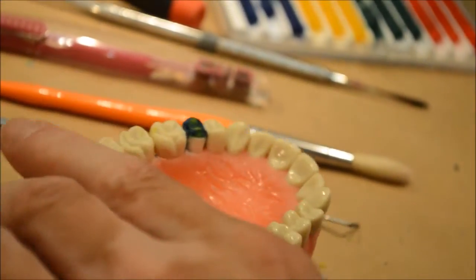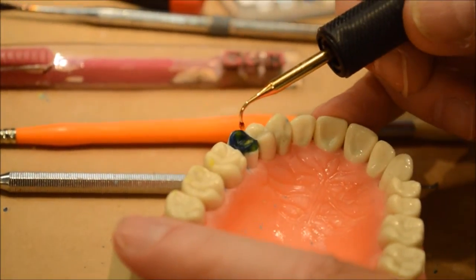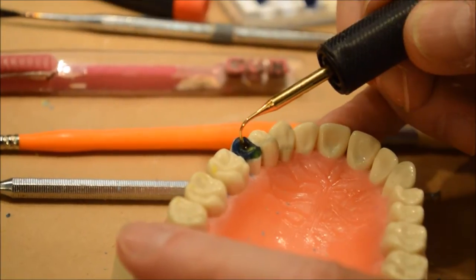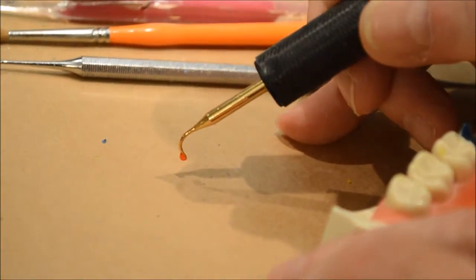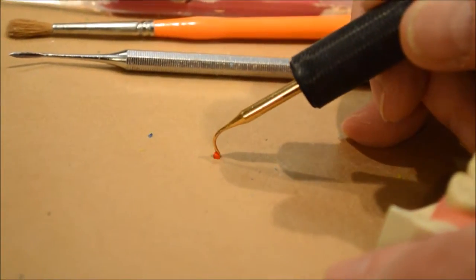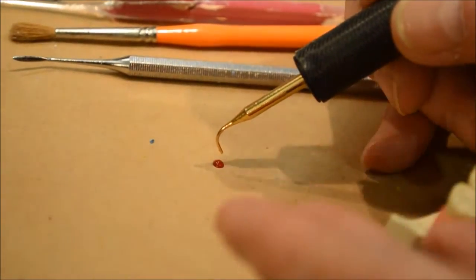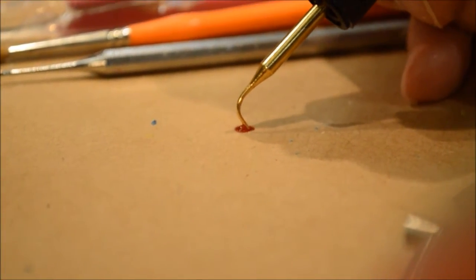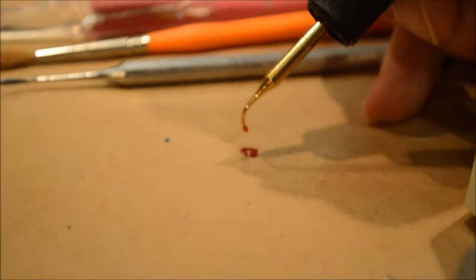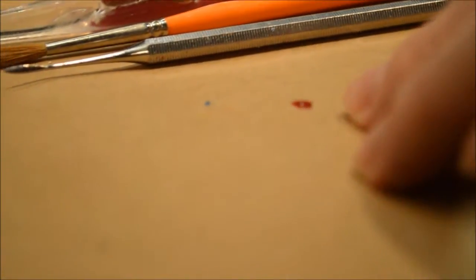Okay, now we're going to put in what we call triangular ridges. They are triangular, so we start at the tip of the cusp and we make a triangle. Remember at the very beginning I showed you — if you take and put a little blob of wax on there and keep adding wax to it in the center, if you look at it very close you'll see that it's very round. Well, that's what happens when you do these triangular ridges — it's going to be round in the center.